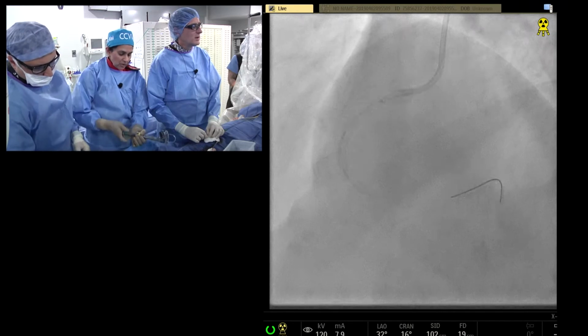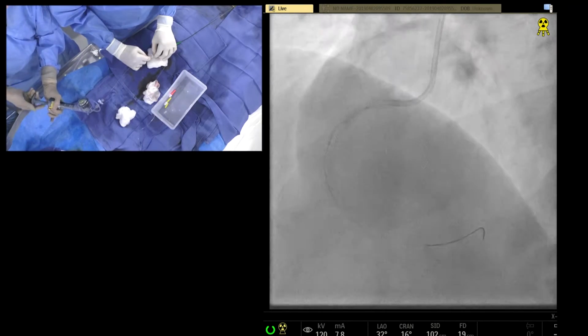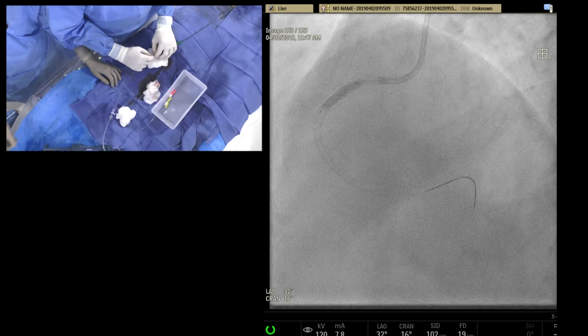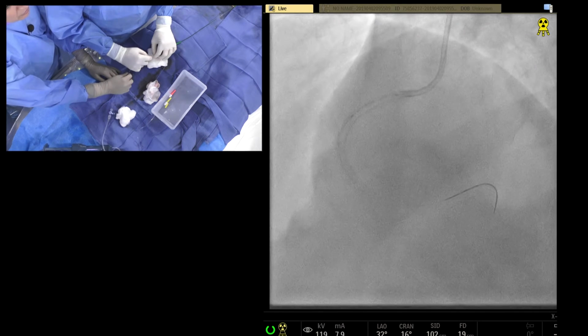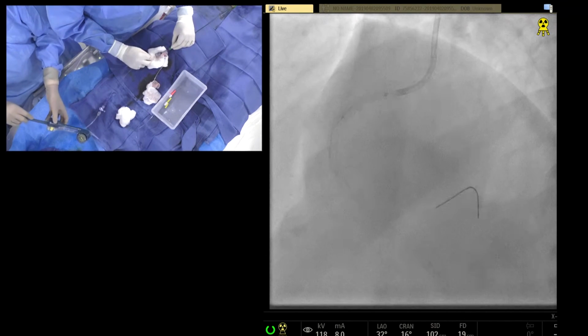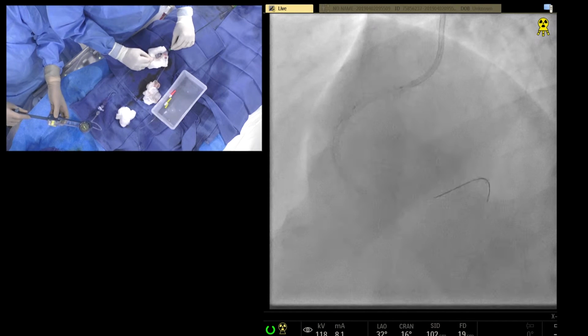Let me just point out one or two things. Number one, atrial fibrillation in the setting of an acute coronary syndrome is among the worst prognostic signs. It's an arrhythmia of pump failure, and it points to the importance of opening this artery. This patient really was threatened by the occlusion of this vessel.